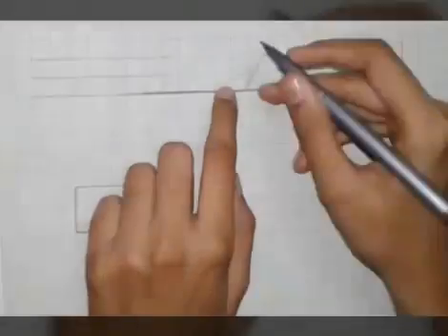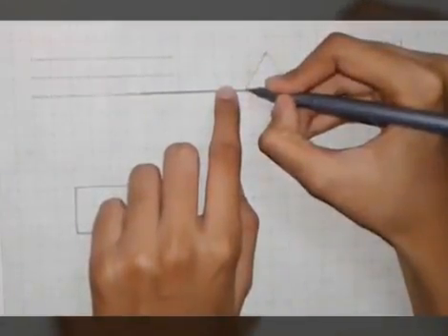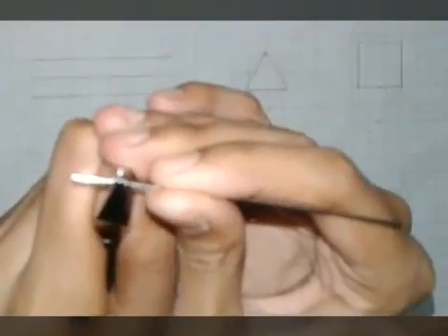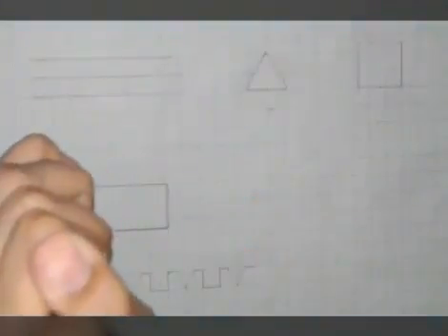I am showing how to do the triangle, how to do the wire bending and adapt the triangle for beginners. In the first step, we want to mark and we want to bend the wire accordingly.